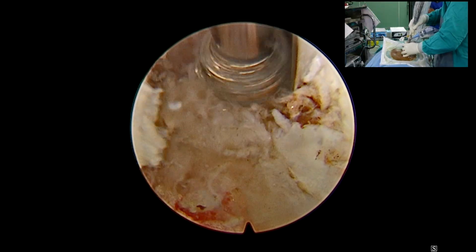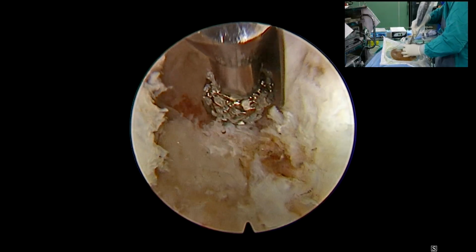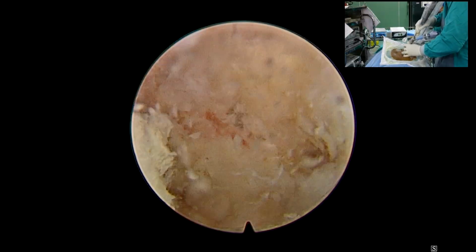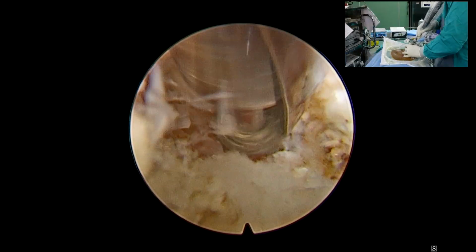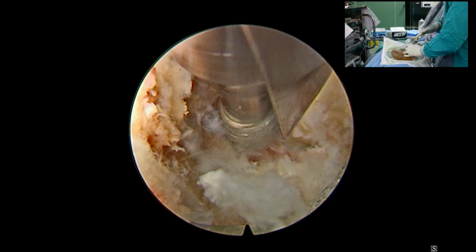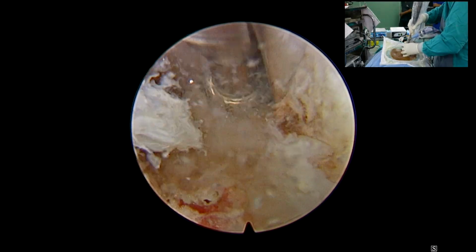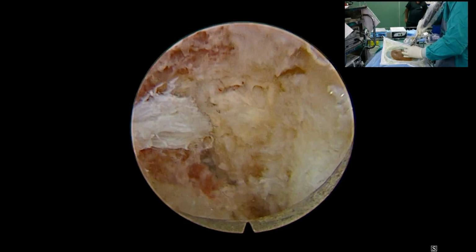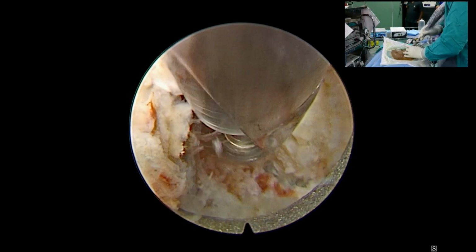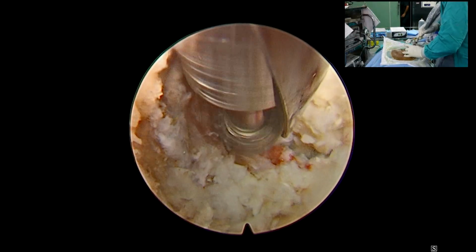The inner surface of the IAP. He's trying to drill there. That's the lamina and IAP junction.